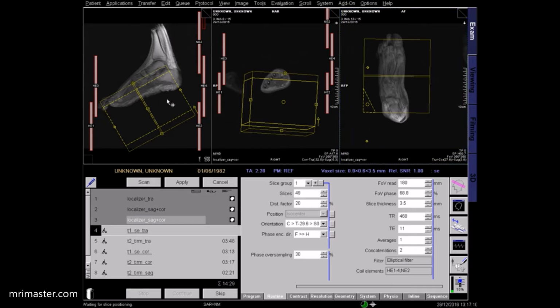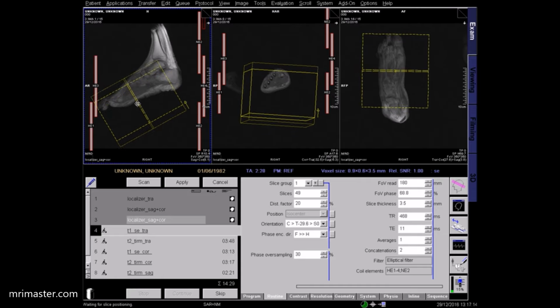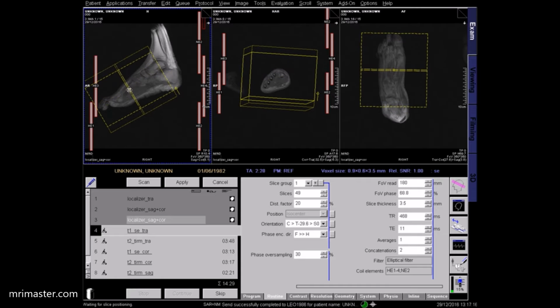In this protocol, the axial images are planned across the short axis of the foot, even though in the anatomical position, this is a coronal view. This may vary depending on radiologist's preferences. On the sagittal plane, plan the axial sequences perpendicular to the metatarsals. Coverage should be from the toes back to the navicular and cuboid bones. Center the field of view on the axial localizer.